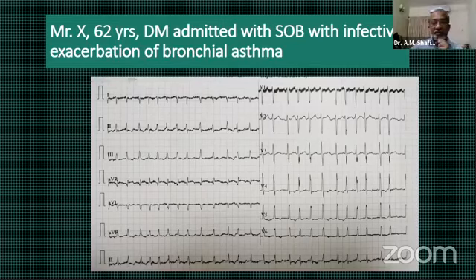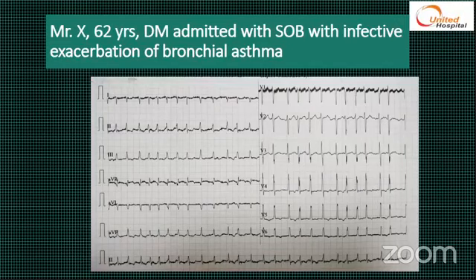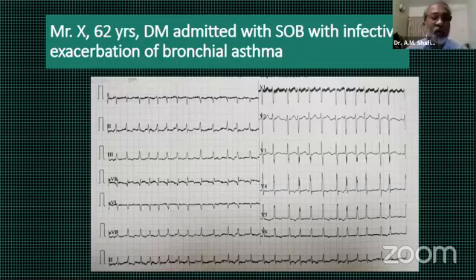The same patient doesn't have any chest pain. Sir, and this ECG. Now, what is the likely cause? Actually, you have already told negative R wave in 1 and AVL and positive R wave in AVR. What is the problem? Is it dextrocardia?